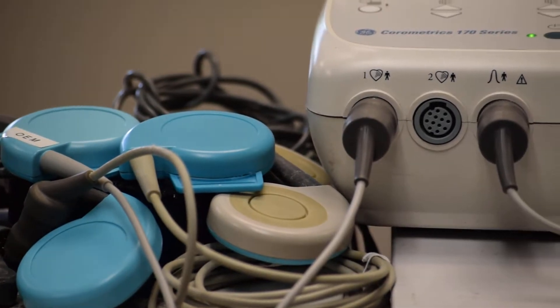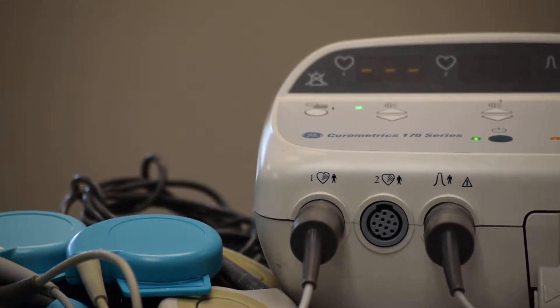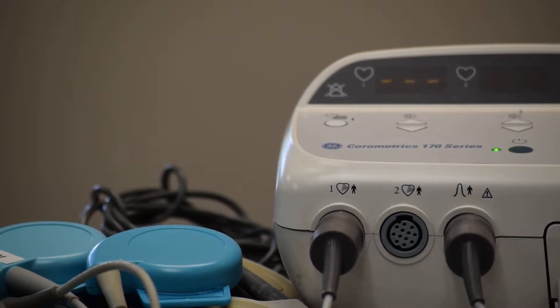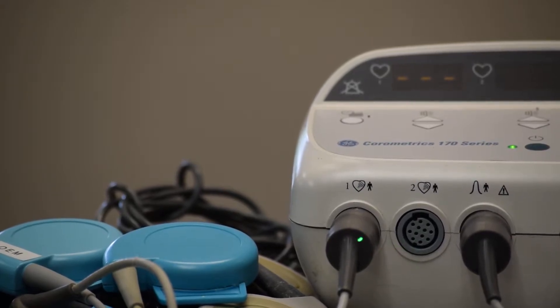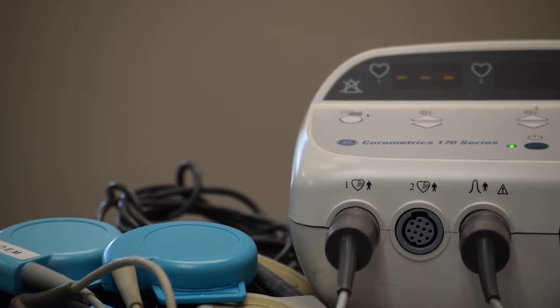As you can see on the fetus heart rate display, channel one shows three dashes — there is no spurious signal, as it is a 100% original transducer. There is no spurious signal pickup. We are going to connect the non-OEM transducer to port one, and port two will again have the OEM transducer connected, to see what happens.